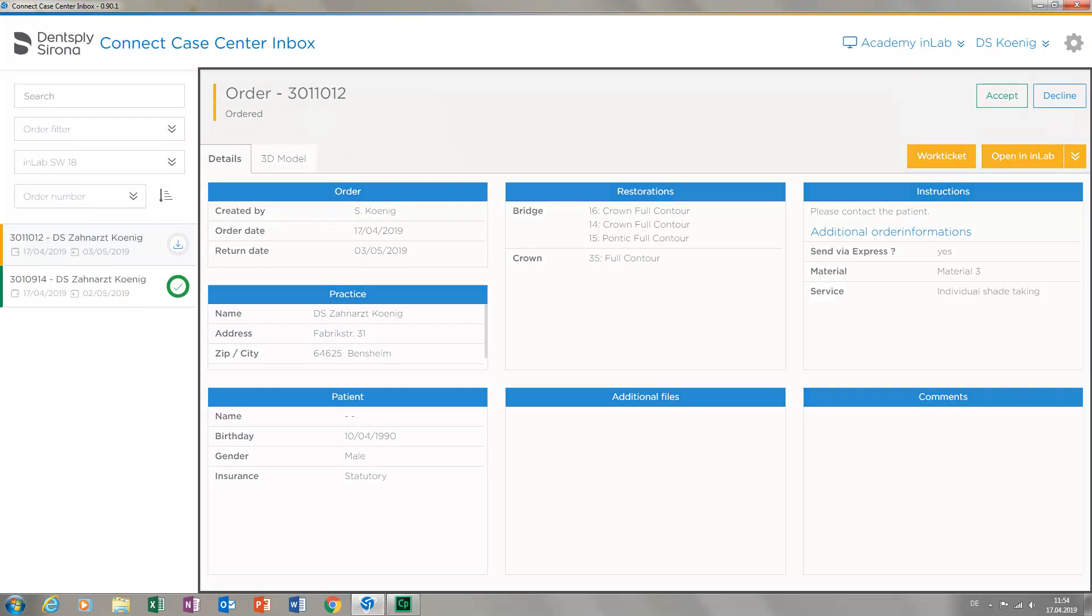In the section to the right of this, you find more details regarding the case. This includes information such as the return date and the number and type of restorations, conditions, as well as additional optional order details of the treating dentist, for example.